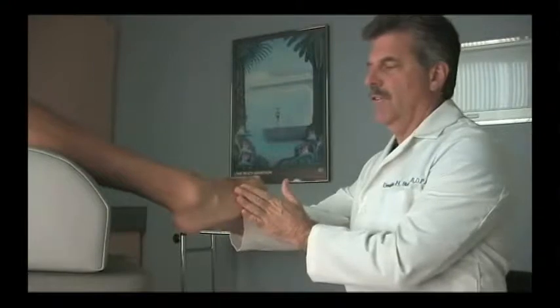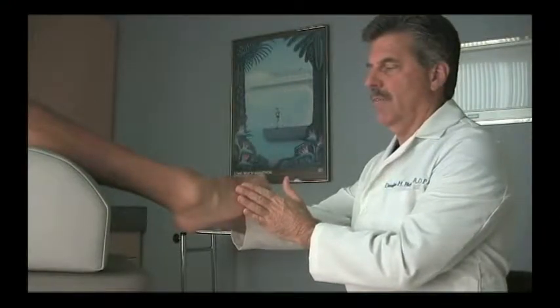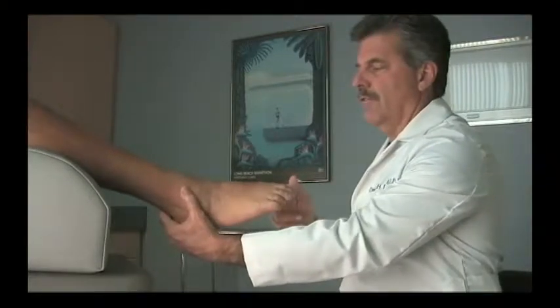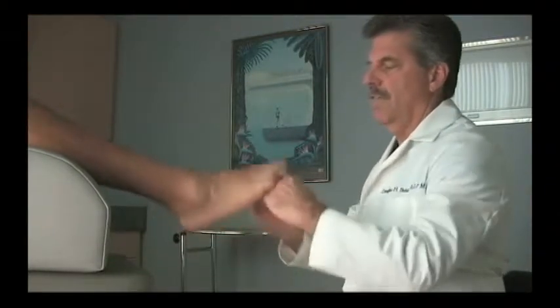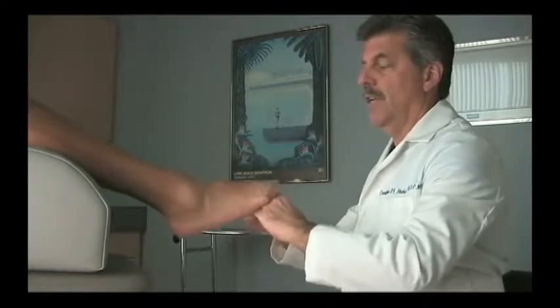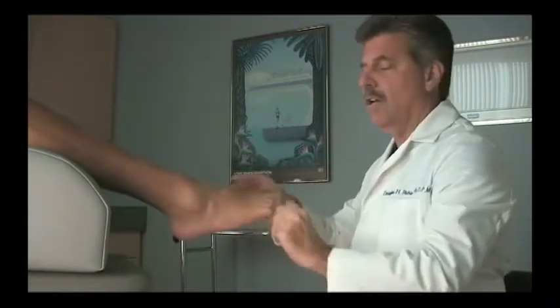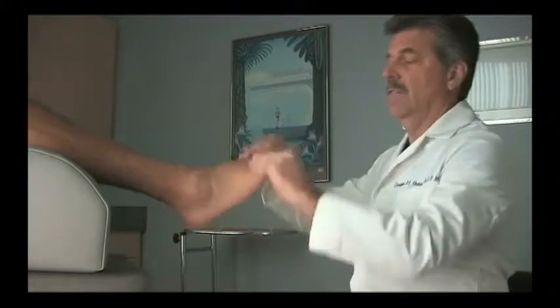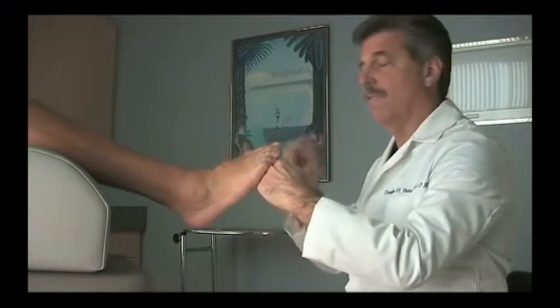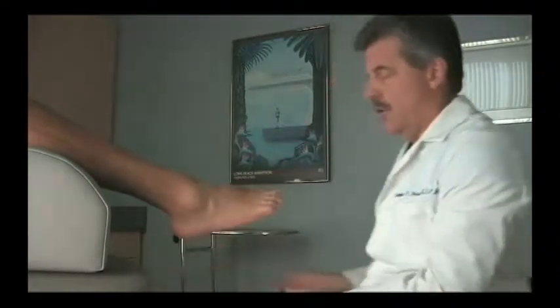There's no eversion strength at all as they attempt to push against my hand. And in this case, very little inversion strength, just a little. Fairly good plantar flexion strength though, but no spasticity. So the main criteria is flaccid drop foot, no spasticity with loading, and finally, no equinus.